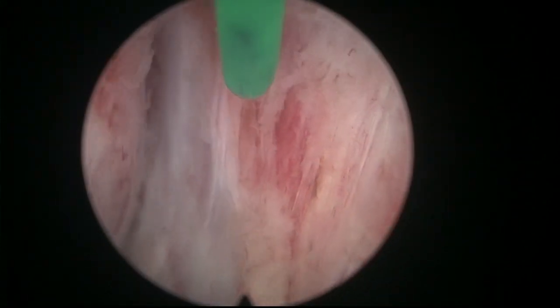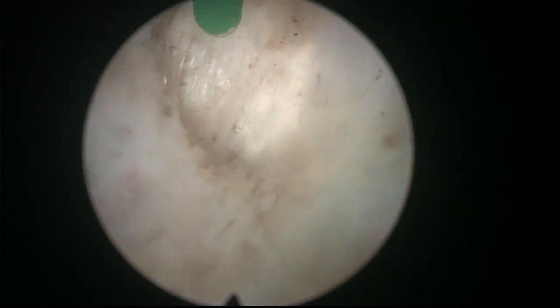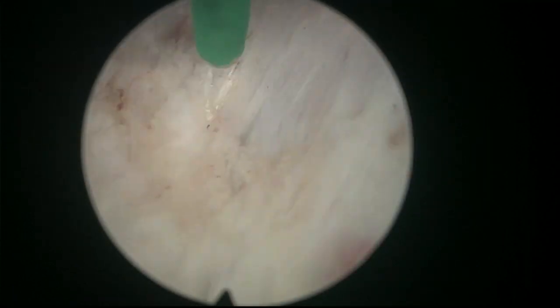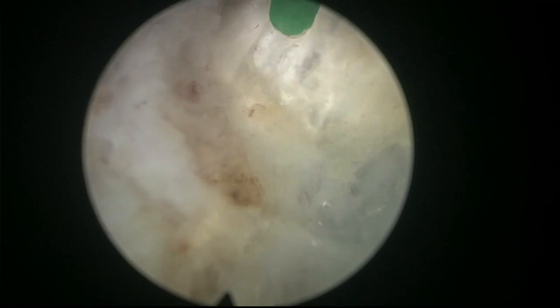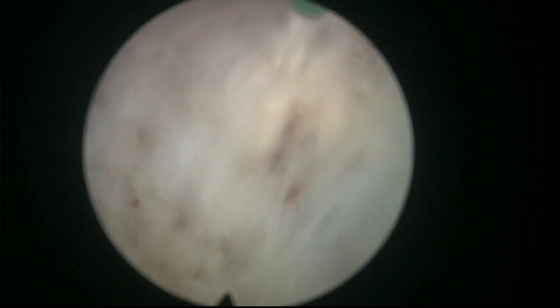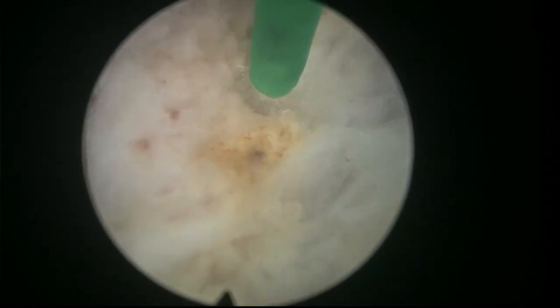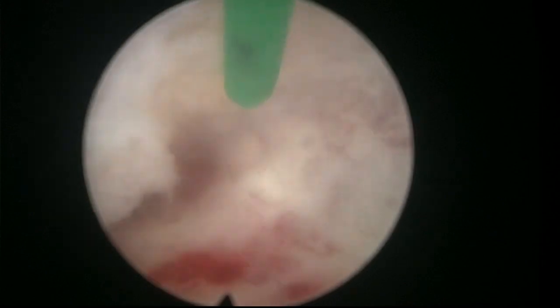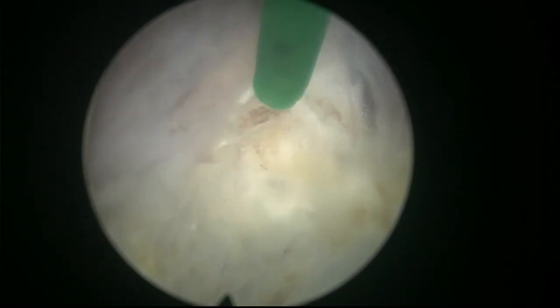Yeah, this is a very good plane. Let's see what happens here. You see, you have to look back many times to check, because the prostate is not a perfect sphere, and sometimes we might have taken a slightly deeper plane. Maybe the plane doesn't coincide totally with the one you're developing, so you have to make things better and better. Connect the planes when there's no natural connection.